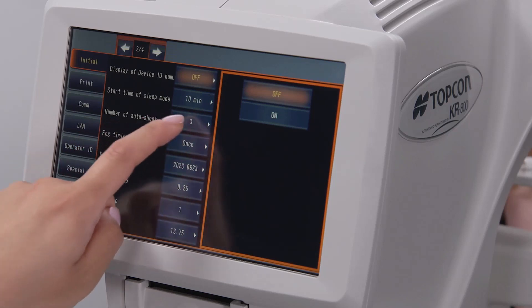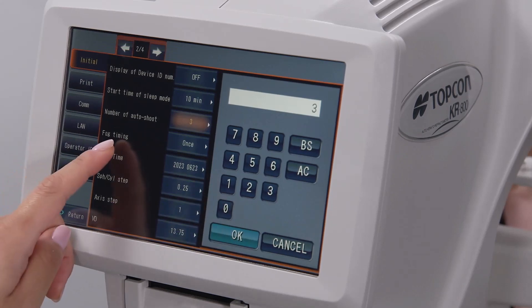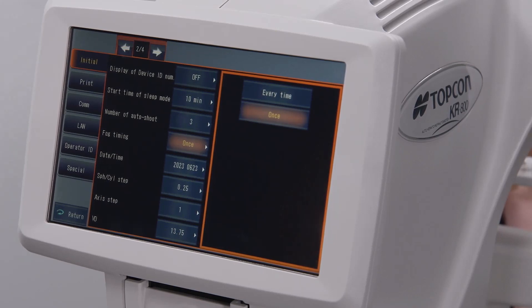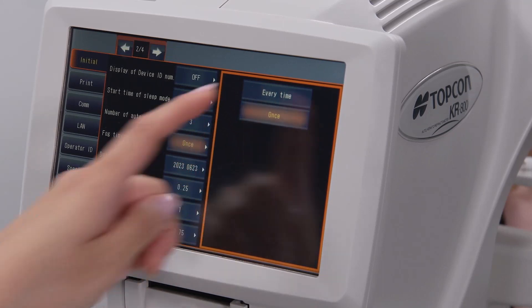Number of Autoshoot determines how many measurements are acquired of each eye. The usual number is 3. Fog timing determines how often the patient will have their vision fog to help prevent the autorefraction from being over minused. The options are once before the first measurement of each eye or once before every measurement.